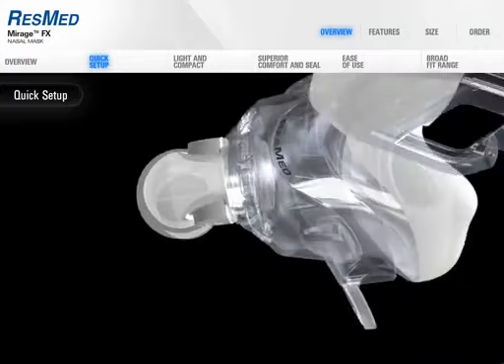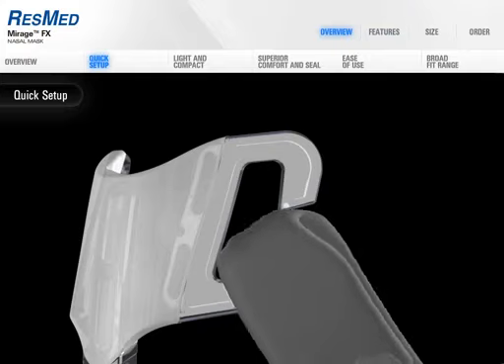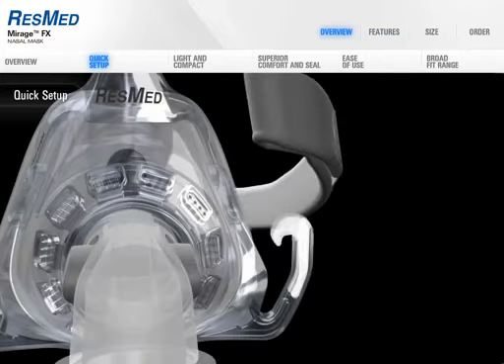Easy to clean, easy to fit, easy to adjust, without compromising quality, comfort, and performance.